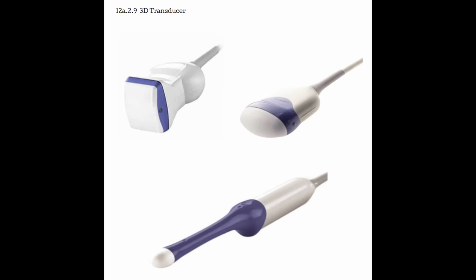There are quite a few ways that a 3D transducer can be made. The one up on top here, this is a linear 3D transducer. We have a curvilinear 3D transducer, and then we have a microconvex 3D transducer that is used in transvaginal application. All of these are going to have that 2D array setup.